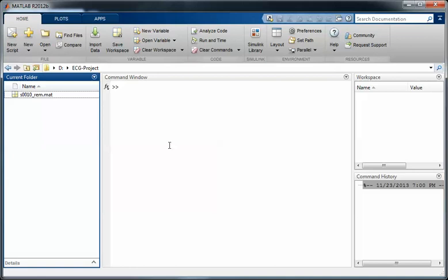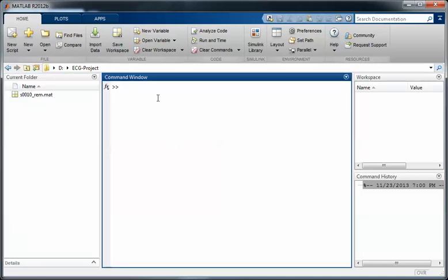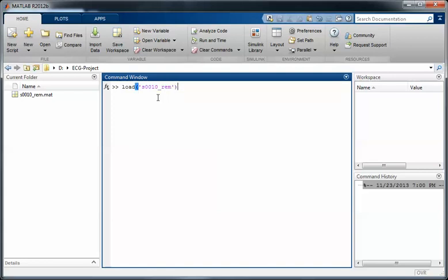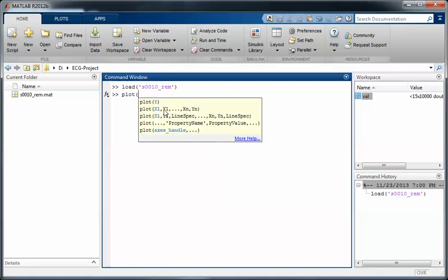And to make a plot and make a visualization of this file, we use this lead one and end of data. So this is the plot of lead one. If you want to show another lead, maybe lead nine, you can just change it.